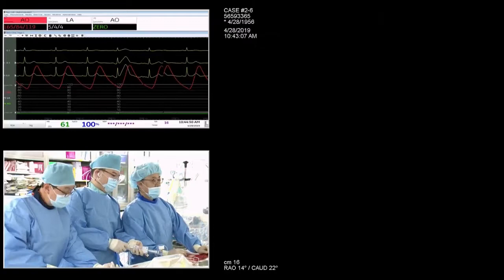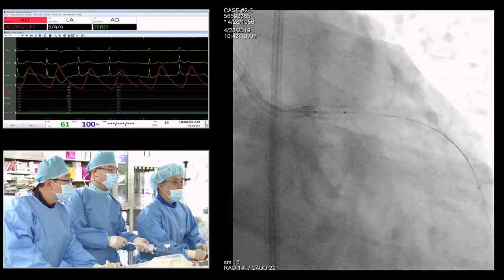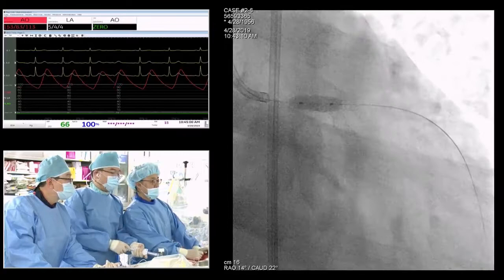Okay, save. Deflate. Okay. Back a little. One more time. 6, 8, 10, 12, 14. Save. Deflate.